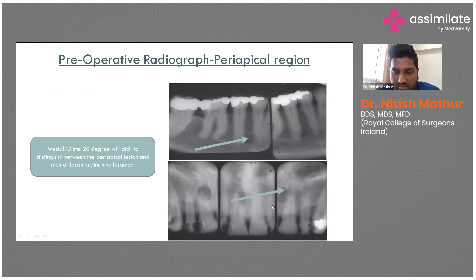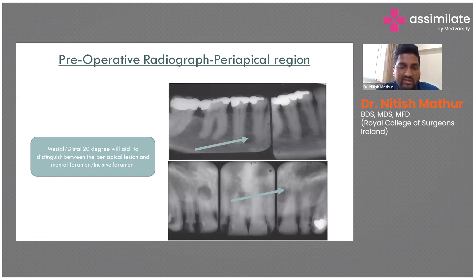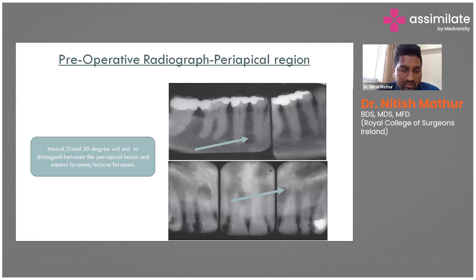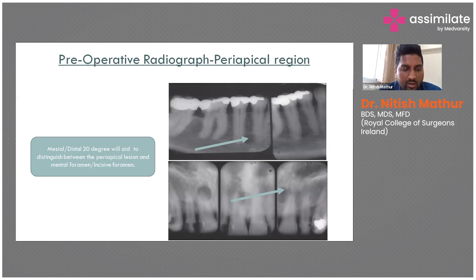The mental foramen and the incisive foramen are two anatomical structures that always mimic a periapical lesion. Changing the horizontal angulation mesially or distally will change their radiographic location, allowing us to visualize the root apex clearly and differentiate them. We need to change the horizontal angulation to confirm.